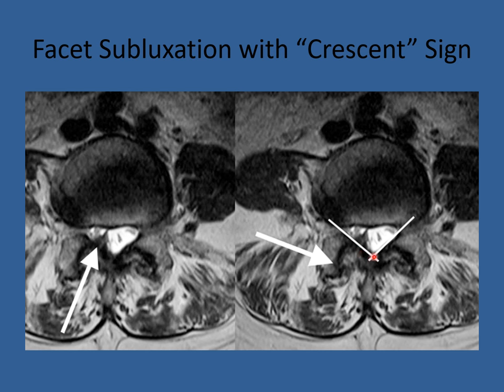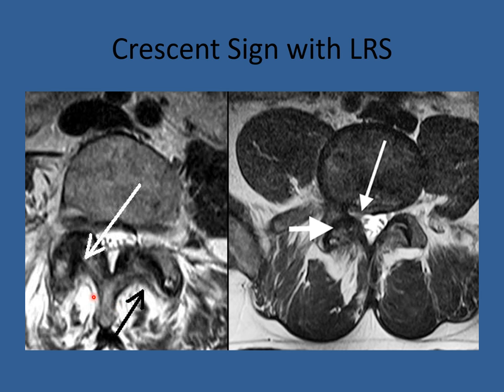I like to look at something called the crescent sign. The facets typically line up, with fronts and backs matching nicely. But if you notice the back of this facet does not match the back of that facet — in fact, this facet is subluxed into the canal. Following the crescent line here, you'll find they line up nicely on one side, but on the other there's a step-off. You can see the step-off more clearly, indicating the facet is subluxed anteriorly — that's a sign of degenerative spondylolisthesis. The crescent sign: follow the line and it abruptly ends into the facet joint itself.